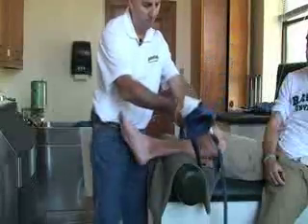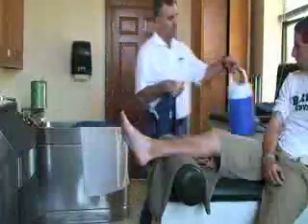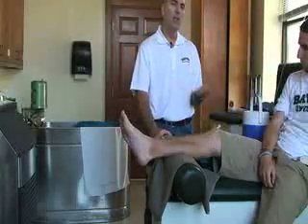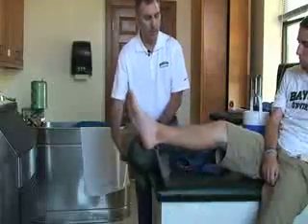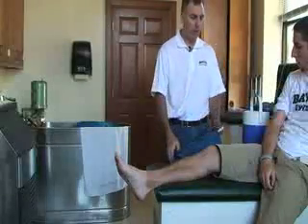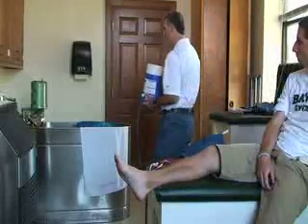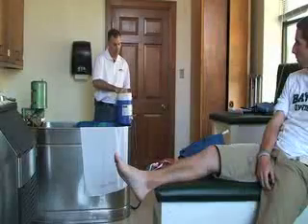Once all the water is out, disconnect the attachment. Inspect the area for any discoloration or discomfort, and instruct the patient to continue icing for 30 minutes every two hours. Put away equipment — the dirty towel goes in the laundry. Record the treatment on the chart, and instruct the patient when to come back. Leave the hose on the attachment until you can dump the water into a sink or whirlpool.